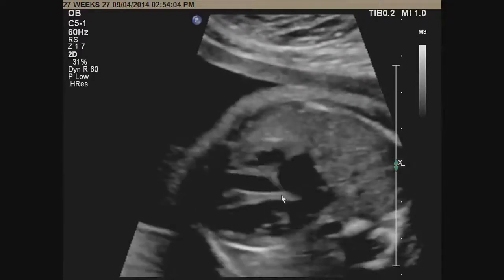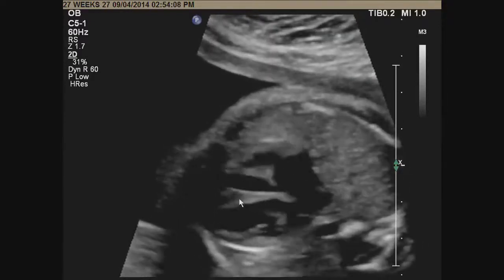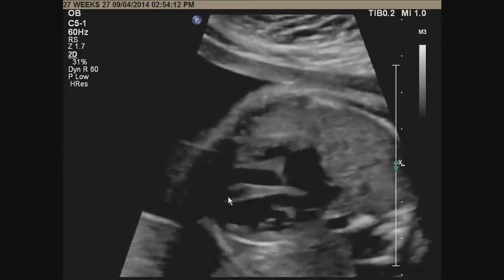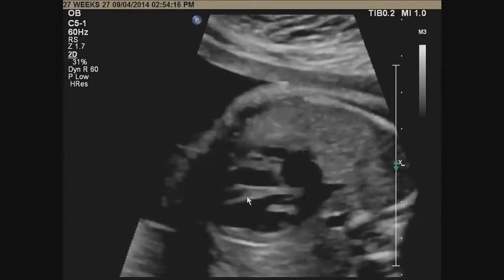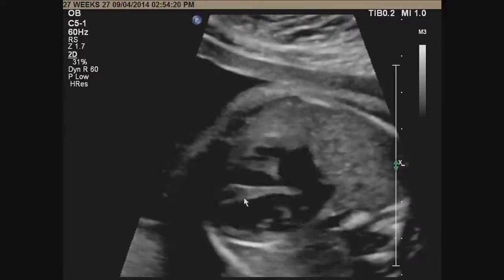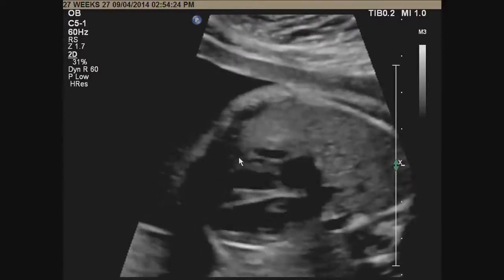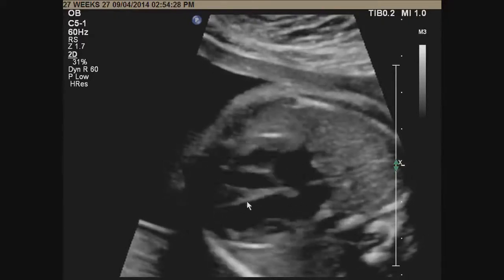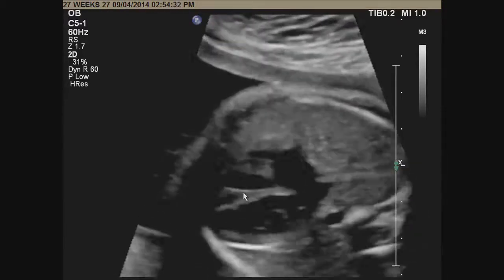And then I'm going to look at the ventricular septum. So I'm going to look at the integrity of the septum here in the four-chamber view, at least on 2D. Then we'll try to look at color, and I'll show you. That's probably the optimal way to look at the septum on color Doppler, because it allows you to detect very small muscular VSDs. You see blood flow across, because you're parallel to the orientation of flow. So your cosine in the Doppler equation of 0 degrees equals 1. So you actually are not attenuating any blood flow by doing it that way.